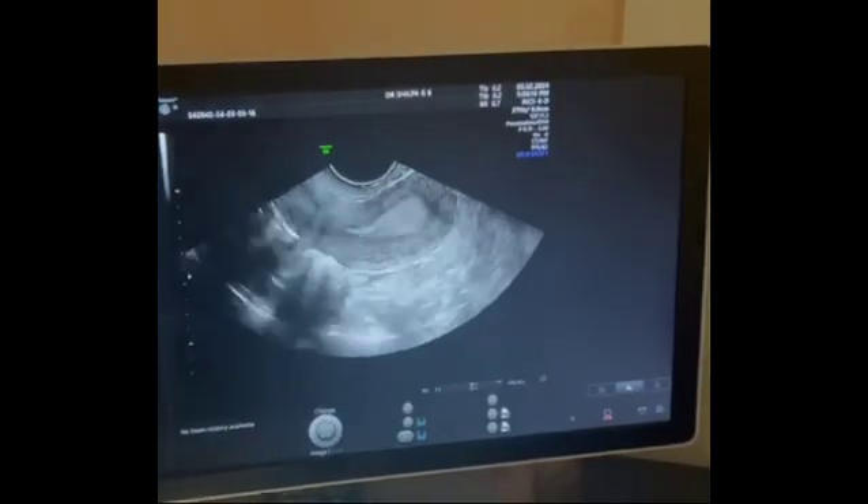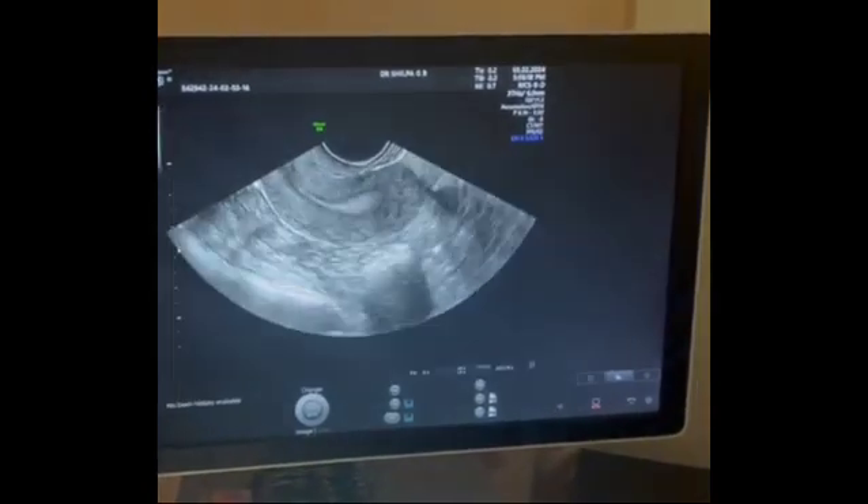This is a 26-year-old patient with a right unicornate uterus on HSG. She has been married for two years and is trying to conceive. I have done a transvaginal scan on the same patient, and this is the sagittal section.